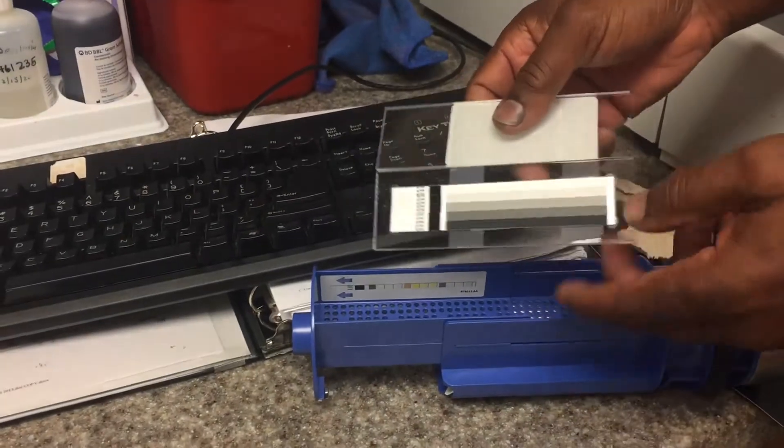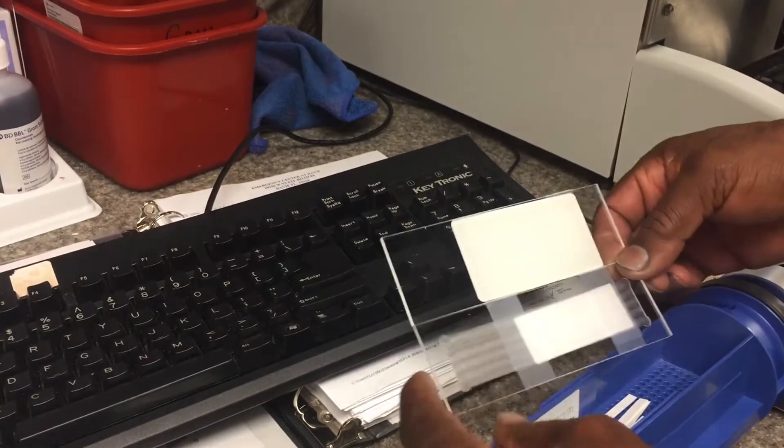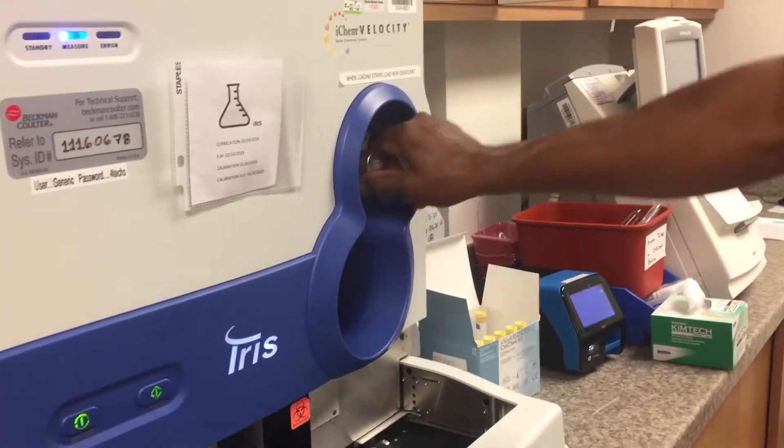You're going to put it like this, so the black faces are in those directions. You're going to put them in here and the strip loader here. Put this in and turn it down.